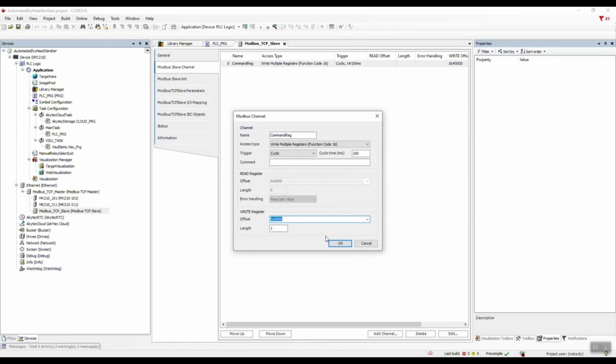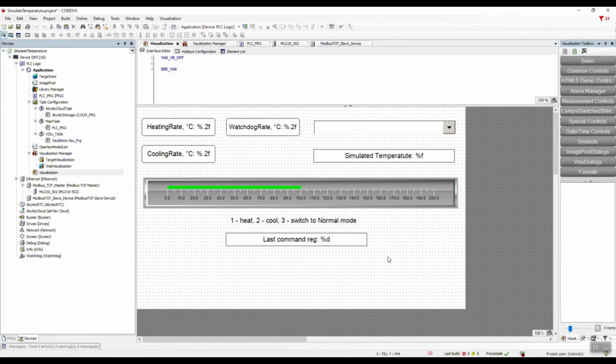Now we can send any commands to the emulator from our main project. For example, a command to heat or cool the sterilizer tank. Write in the comments: how would you change the emulator's algorithm and functionality, taking into account characteristics like the sterilizer's capacity, heater power, and thermal insulation?